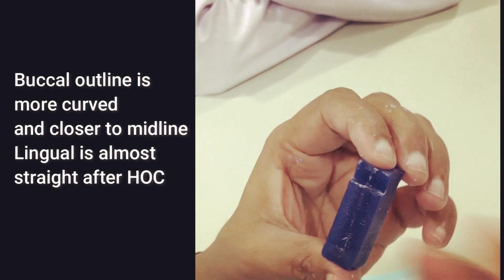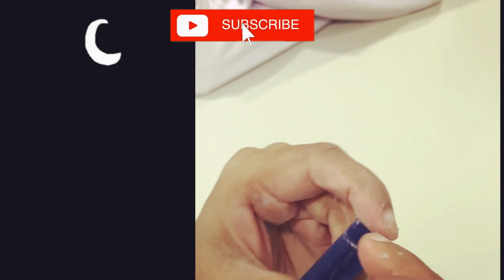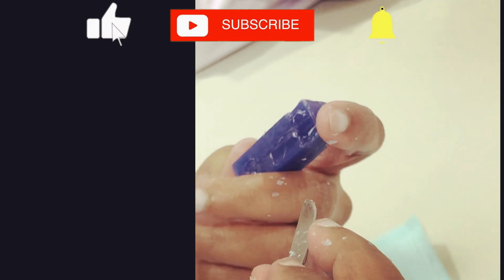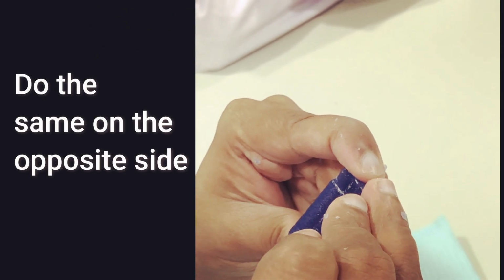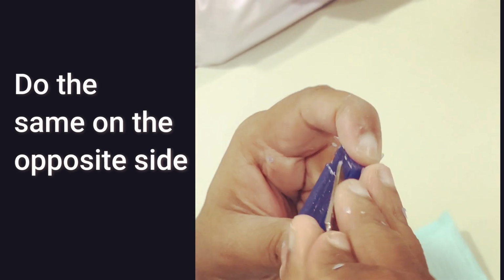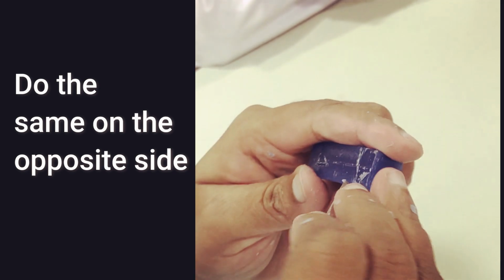Okay, so the same thing I'm going to do on the distal side as well. So this is the buccal, cervical 1/3, height of contour, go close to the midline.